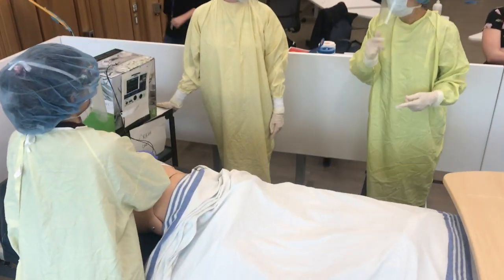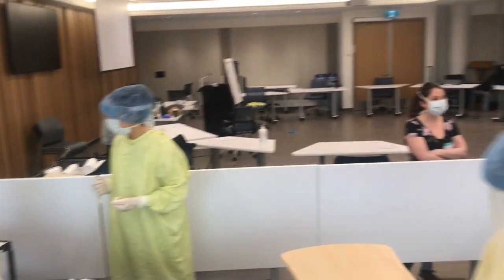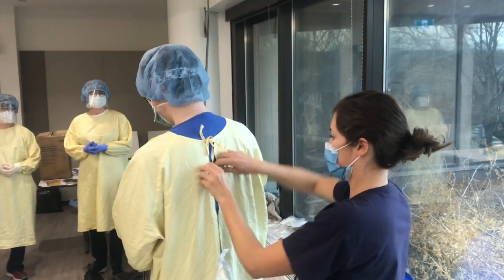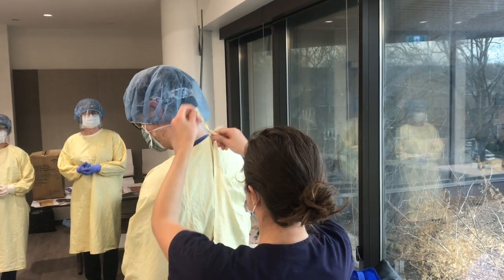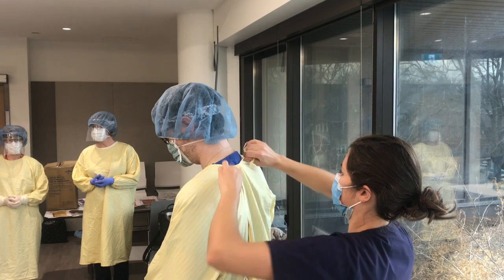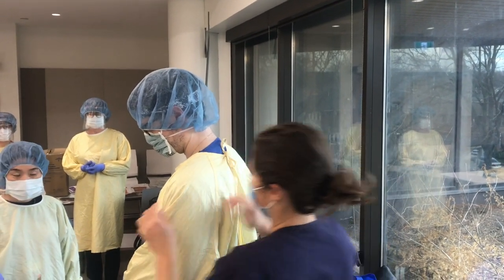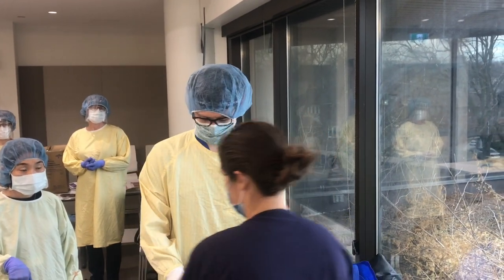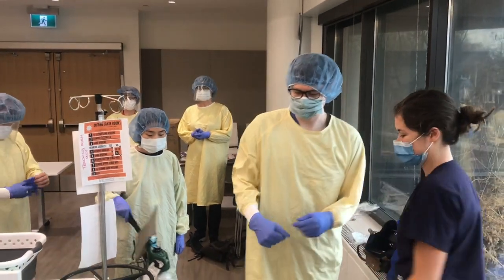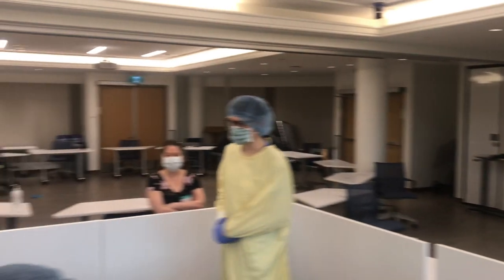So we now have 2 nurses in the room, one doing CPR, one on the defibrillator, and that third nurse is getting in line to help with compressions. This is the team leader. His PPE is being optimized by the safety officer. So his gown is a little bit loose, he had a lot of neck exposed, so the safety officer is fixing that and optimizing his wrist coverage. Basically everybody can do with a little help covering their wrists up, especially if your institution doesn't have extended gloves. The anesthetist is just arriving there.